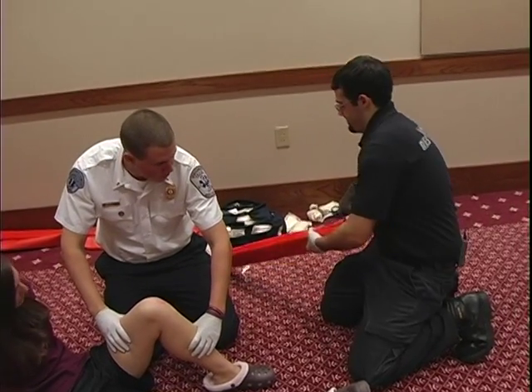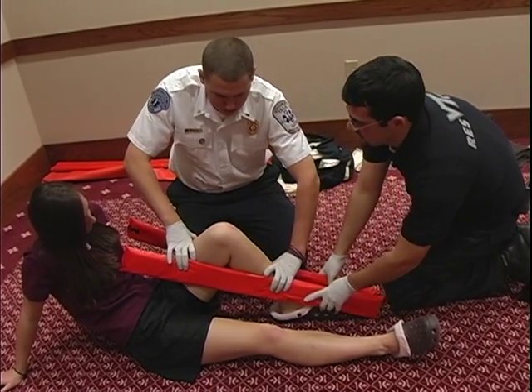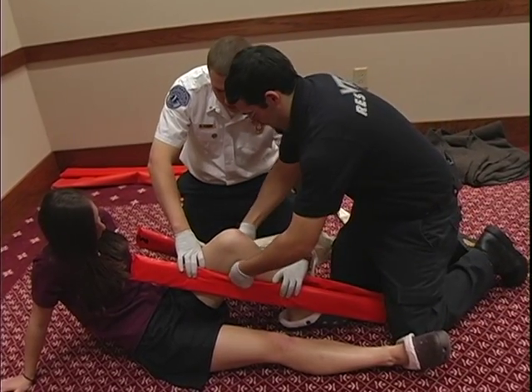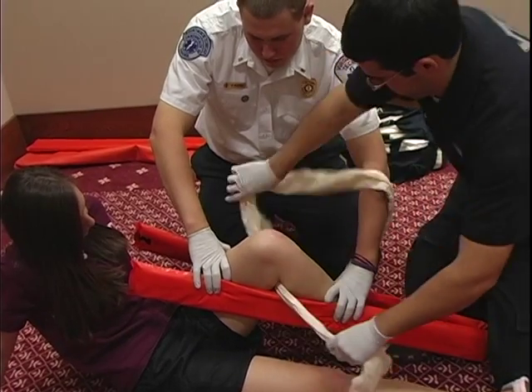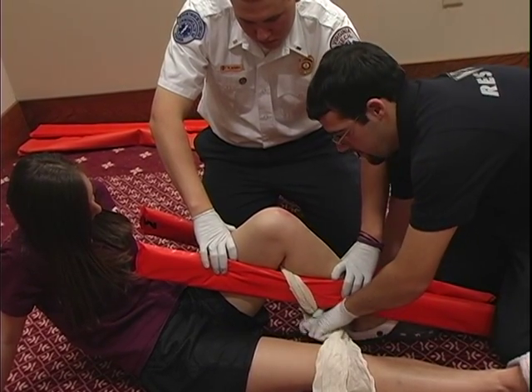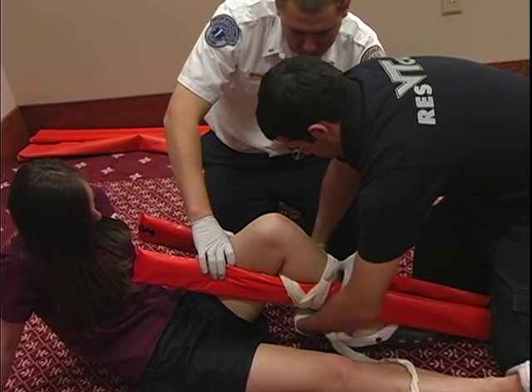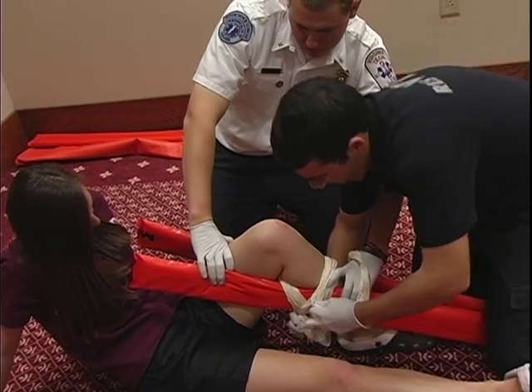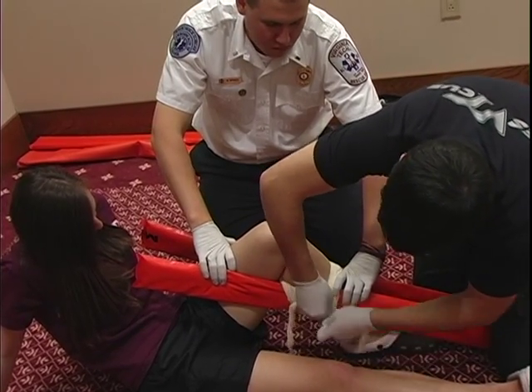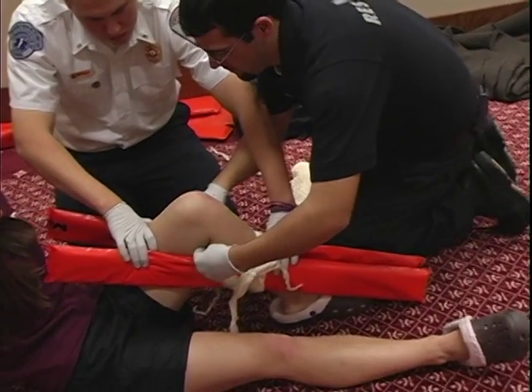We're going to use padded board splints to splint this injury — one on the inside of the leg and one on the outside of the leg — having my assistant hold those while maintaining stabilization. Here we're going to be securing the leg to the splints above and below the injury, now going above the injury.